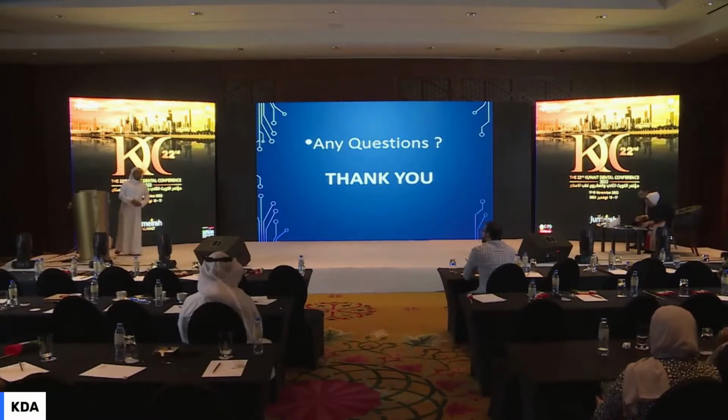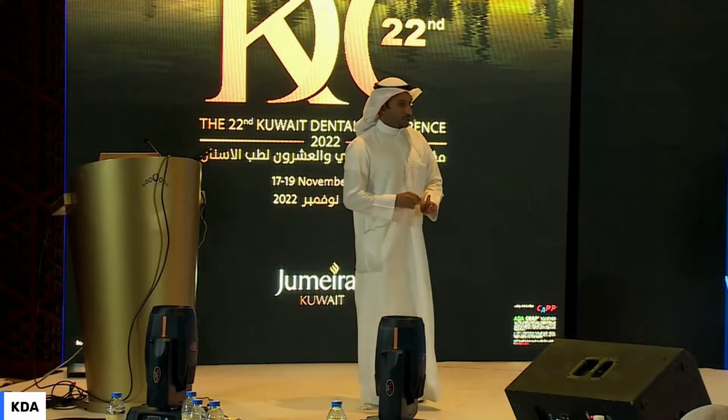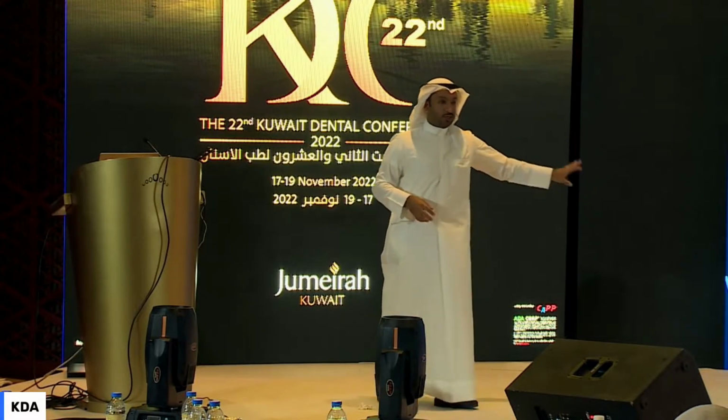Yes, I did. We have two different scan bodies. We have multi-unit scan bodies, and we have the regular scan bodies, which are, again, bone level, abutment level. So in multi-unit, all of the multi-unit, we used a multi-unit scan body or abutment level scan body. So when you're scanning, you're actually scanning the second crown that goes into the prosthesis.